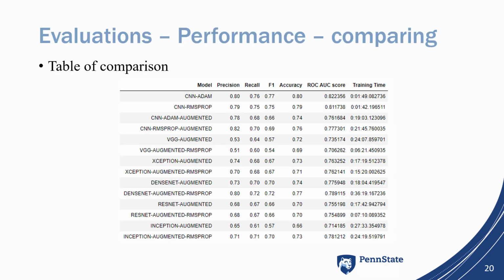And here's the result after we train our model. We created a comparison table to see the performances for all the models in terms of precision, recall, F1, accuracy, ROC AUC score, and training time. We can see the results from various models that we have tested.